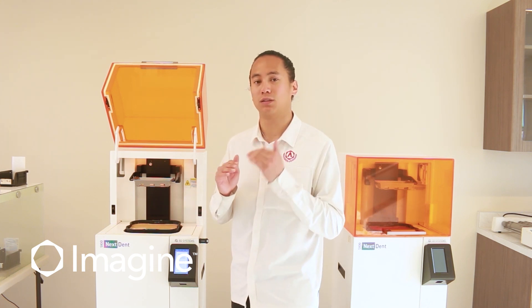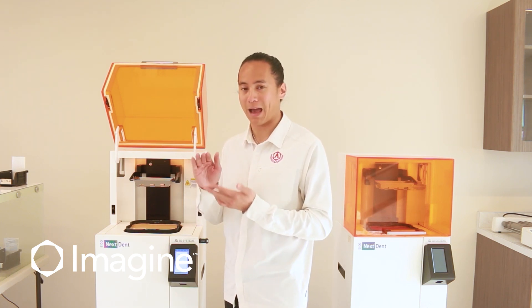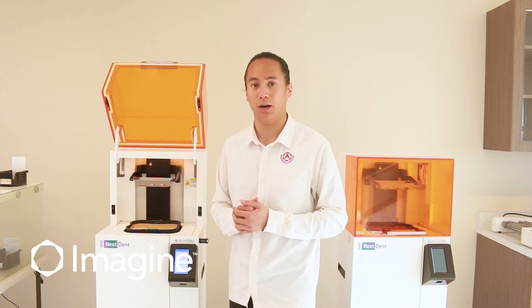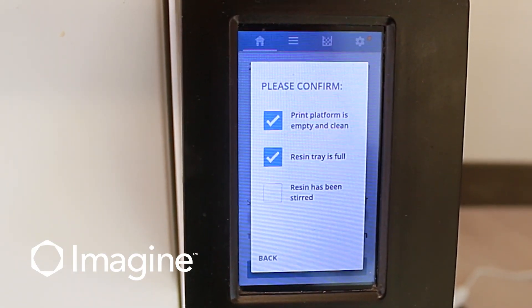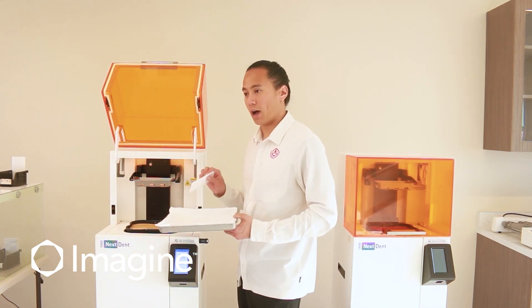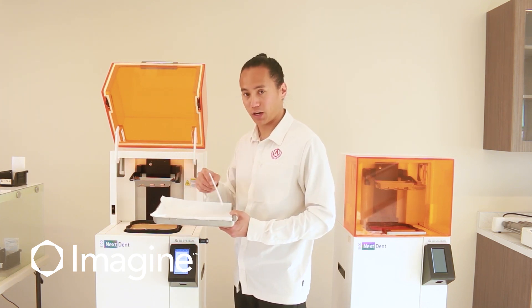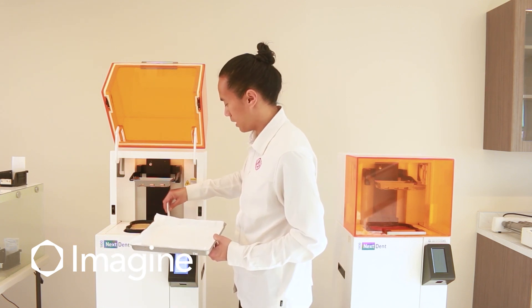Typically, we like to keep the resin level between two and three. If you fill it up too high to the maximum, when you're stirring the material, that can cause spillage on the resin tray. The last thing we have to check is to make sure that the resin tray has been stirred. We'll go ahead and grab our spatula to do so. When I stir the resin tray while it's in the machine, I make sure that I don't apply any downward pressure as we're stirring back and forth, because we do not want to puncture the resin tray's film.